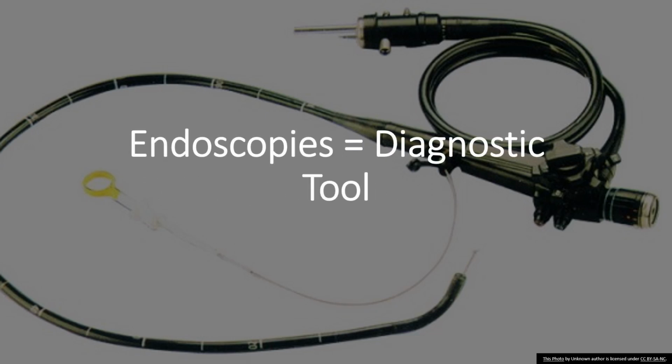Doctors can examine issues such as heartburn, nausea, vomiting, abdominal pain, difficulty swallowing, gastrointestinal issues, bleeding, polyps, and much more. And it can also be utilized for things like biopsies and other small procedures.